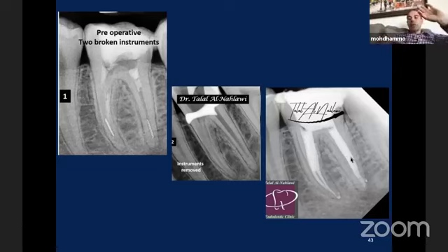You are excellent because you removed it, but unfortunately, we sacrificed a good amount of dentine, which means I think we have to stop insisting on removal a little bit and go more for bypassing, because we can preserve more dentine. Do you agree with me? I agree to a certain limit. As I told you, it's a learning curve, dear Mohammed. You see now one clinical case, maybe I did it 1 year before. The last one I presented.